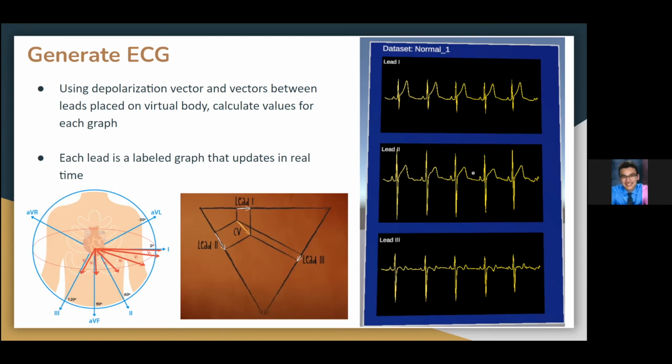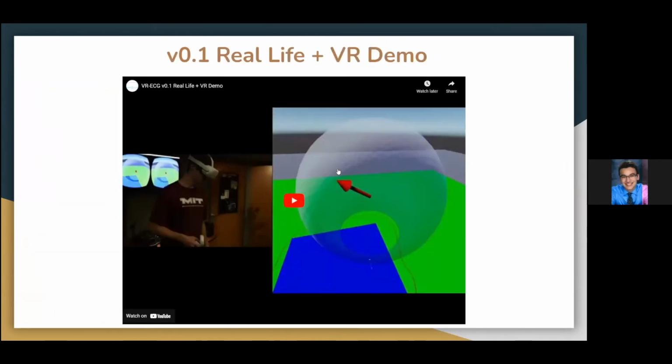Like we said before, that's one of the biggest goals of the program: as you see these plots in real time, you can move things around and see what's actually happening with the output of your data. If I move sticky number 2 a few inches in this direction, what's going to change? Is that going to make my graph look like it's diseased? Is that going to make it unreadable? Is that going to keep it the same? That's the point of this part of the simulation, seeing the outcome of your actions on the person. So if we go to the next slide, please.